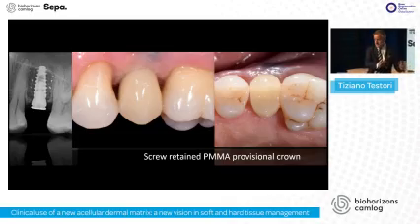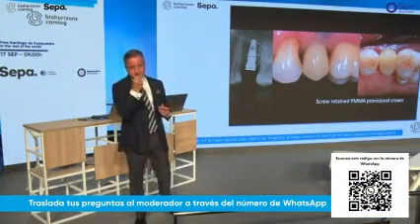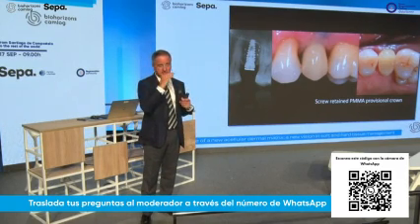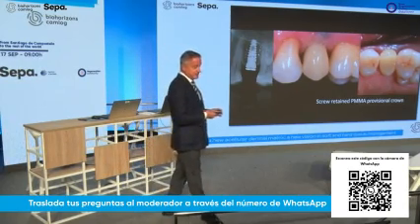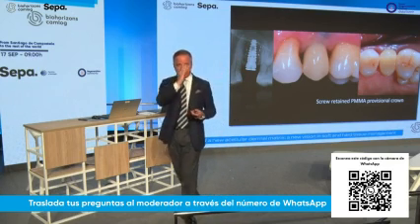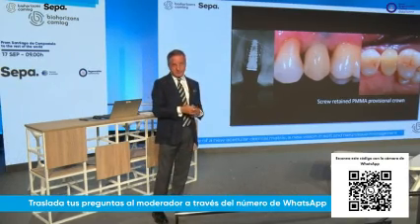between the natural teeth and the implants, because every time you have a concavity in an aesthetic area, you have a different diffraction of the light, so the reflection of the light is completely different, and that can be an aesthetic problem, the famous umbrella type of problem depicted by Pascal Magne in his publication, or every time you have a concavity, you can have horizontal food impaction.